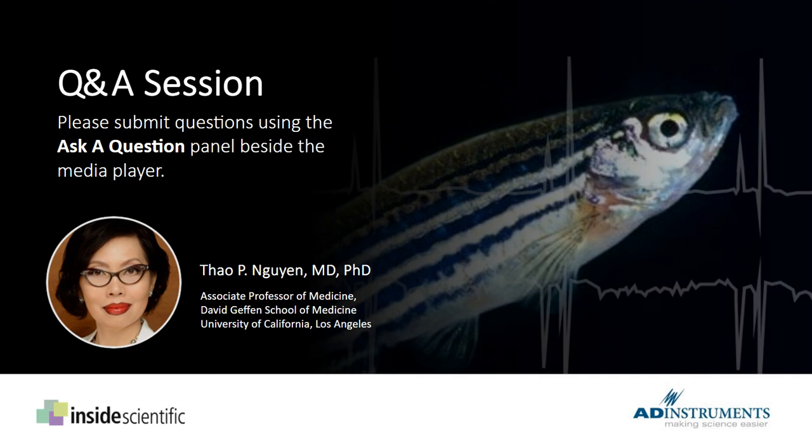It's almost as large, if not sometimes larger than the zebrafish ventricle. And you know that the voltage signals on EKG is relative to the myocardial mass. So if the fish has a large atrium, it would reflect in having a large P wave.